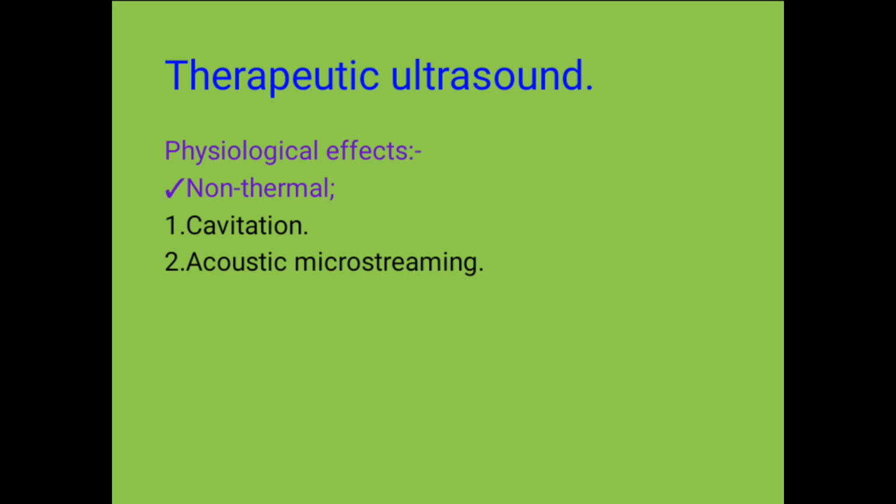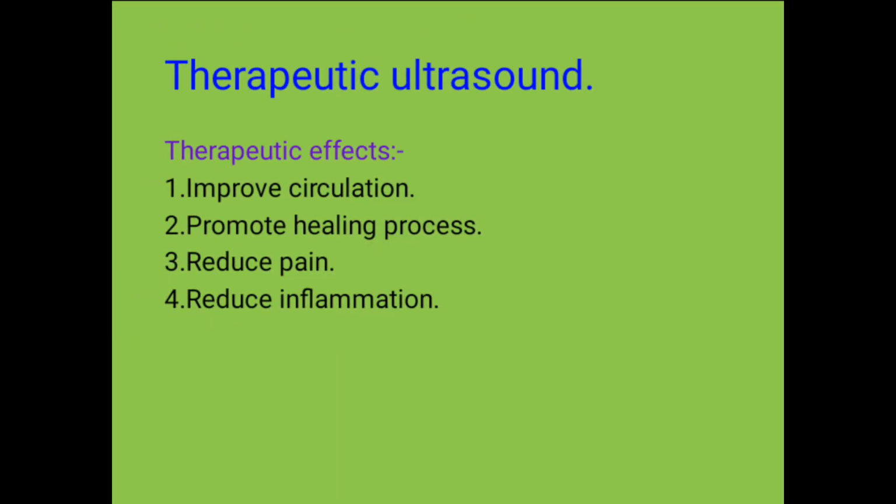Before you do your settings, you ensure that the transducer is in contact with the skin, so that you do your settings and start your therapy. You do not let the transducer stay on one point. It should be moving to avoid burning your patient. You should move it in a figure 8 form, like you are drawing a figure 8 or a 0. That is the way you should move your therapeutic ultrasound during treatment.